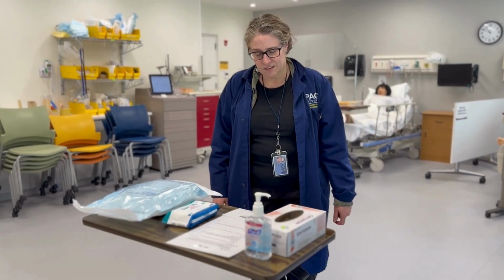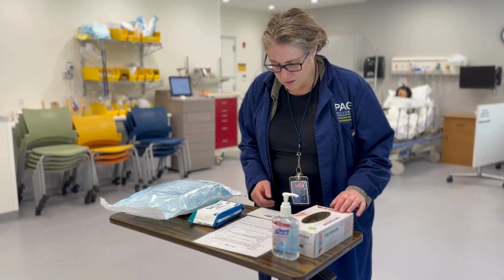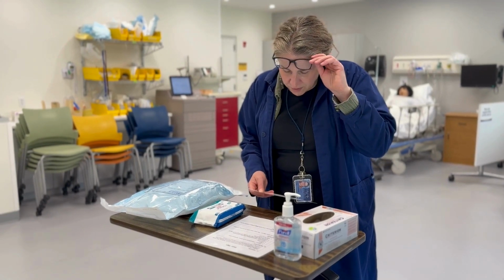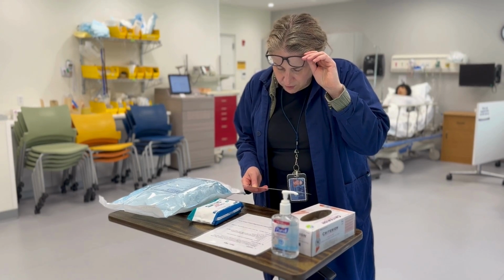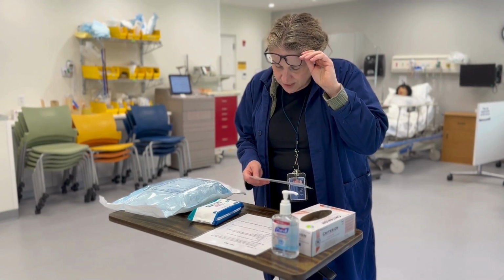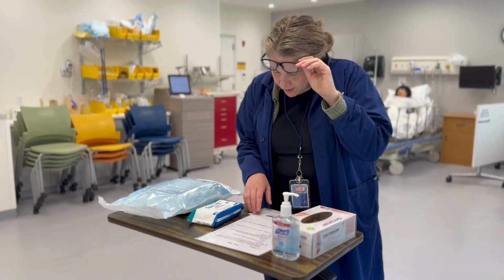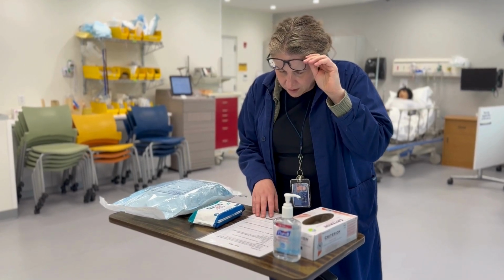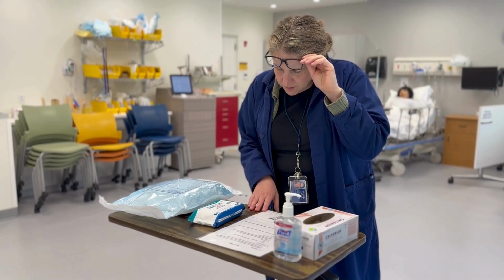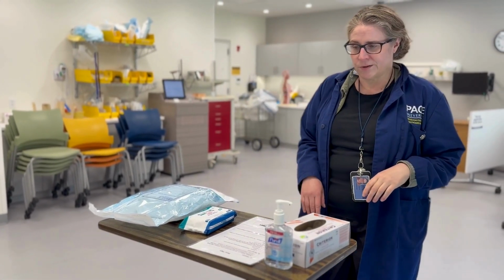Review the order and indication for indwelling catheter and gather equipment. Okay, I see I have an active order from Lisa Williams for inserting an indwelling urinary catheter now for Sydney Tucker. Because the patient has been oliguric and the team wants stricter monitoring of urinary output. So I will put the indwelling urinary catheter in as per the provider order.